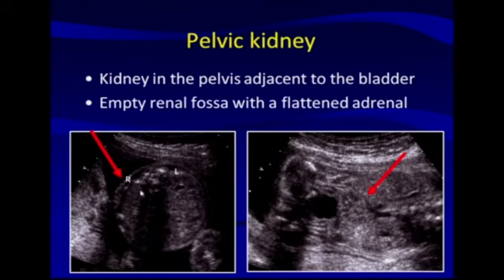And this, of course, could be confirmed in a parasagittal view with the lying down adrenal sign, but instead we looked in the pelvis, and you can see it's a little bit tough to see this sort of transverse positioned kidney sitting above the fetal bladder, low down within the fetal pelvis. This is a pelvic kidney.